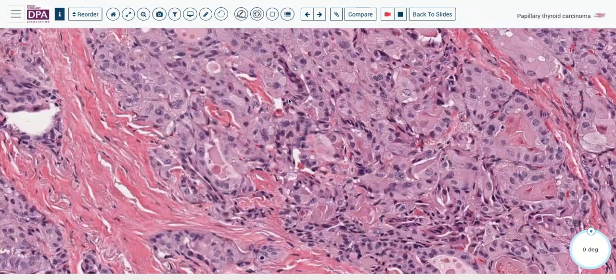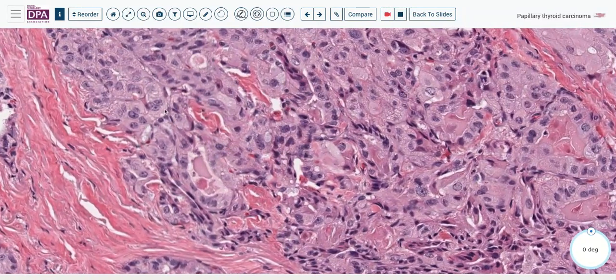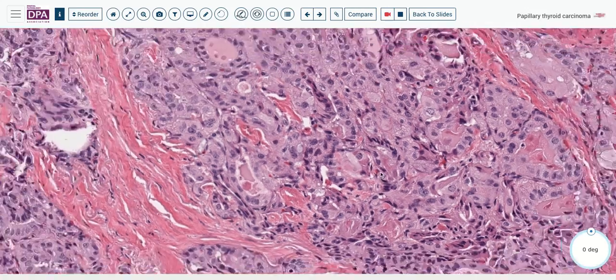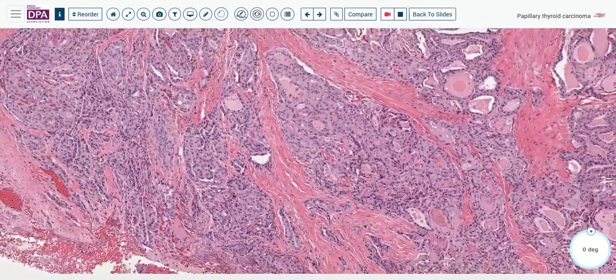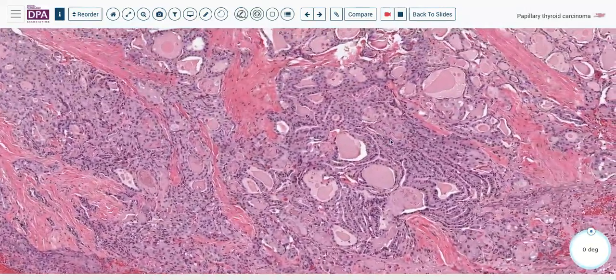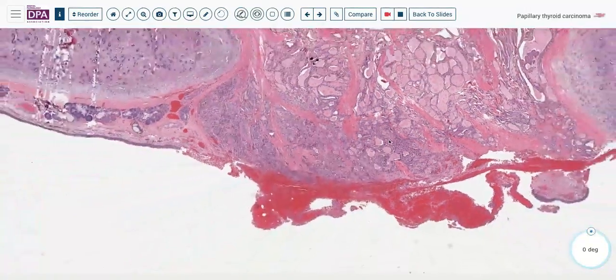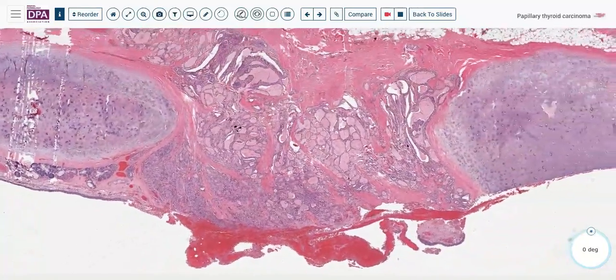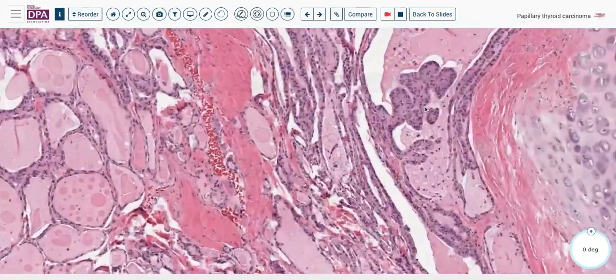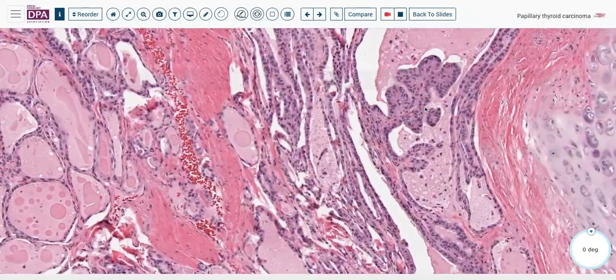Now, why is it not follicular carcinoma since we're making follicles? Well, it's because of these nuclear features with the nucleoli, with the grooves, the clearing and inclusions. Additionally, we have, at least right here, a nice little papillary structure that certainly also goes along with papillary carcinoma.